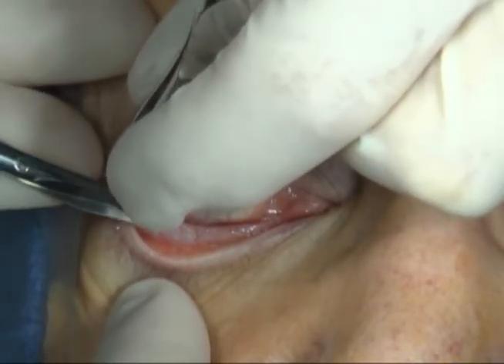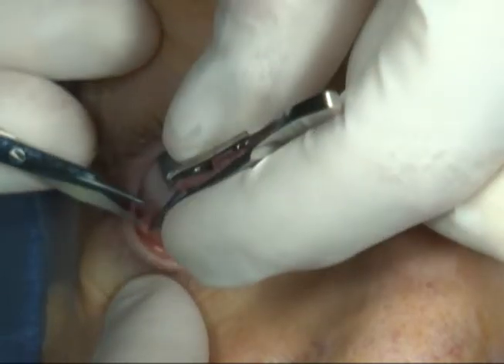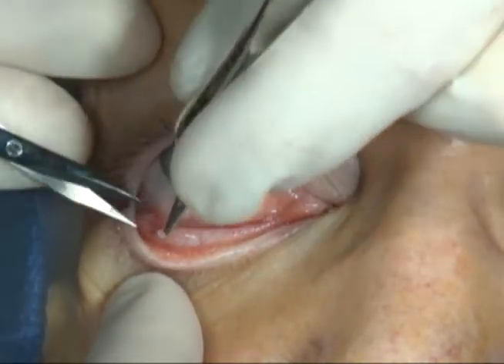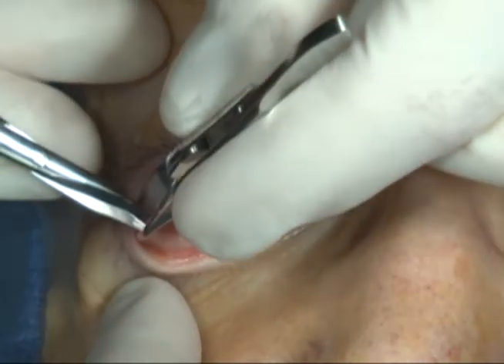The palpebral conjunctiva is exposed, and a specimen is taken from the area between the inferior border of the tarsus and the fornix.